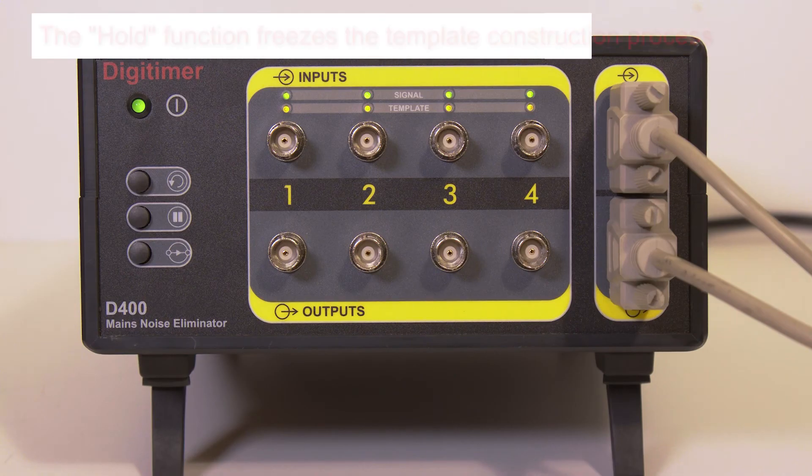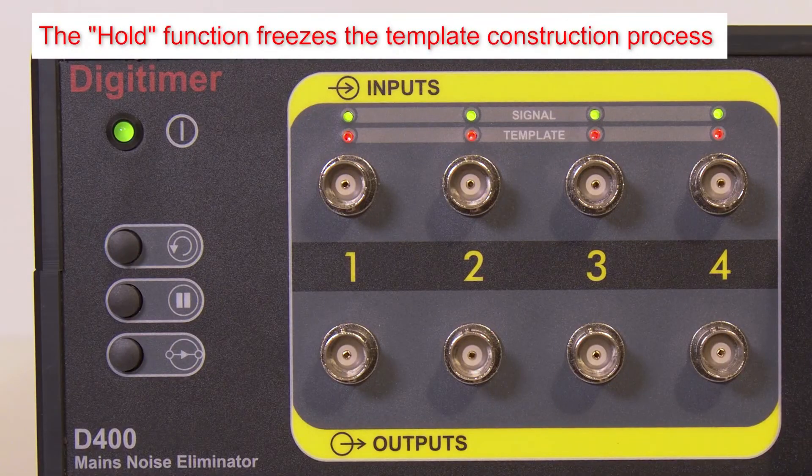The second button is Hold, which freezes the noise template building process until it is pressed again. Briefly freezing the template allows an operator to adjust recording equipment without causing artifactual disturbance to the noise subtraction process.